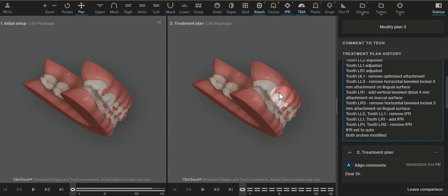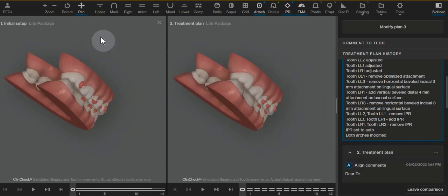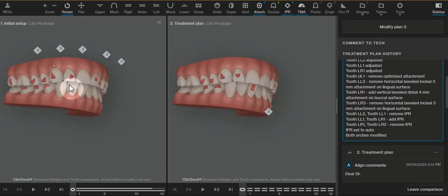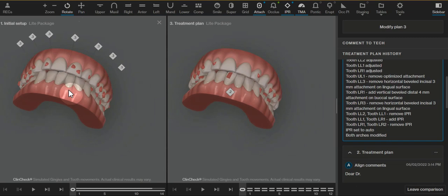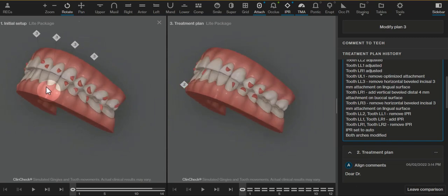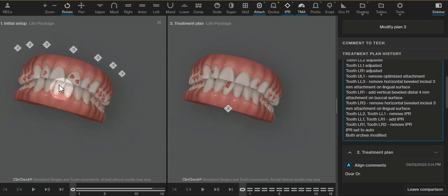Hi doctor, I have this treatment plan much improved and cleaned up from the initial clincheck. We are trying to resolve the crowding and put these teeth into a better position so they're not wearing the anterior as much.